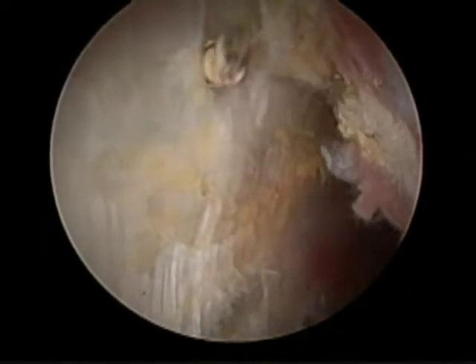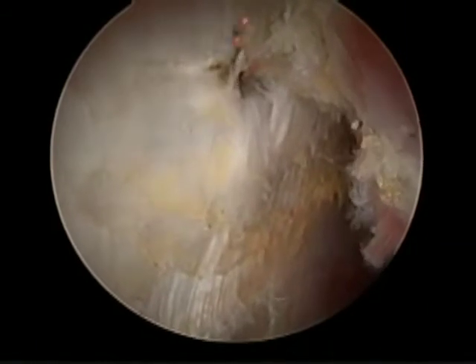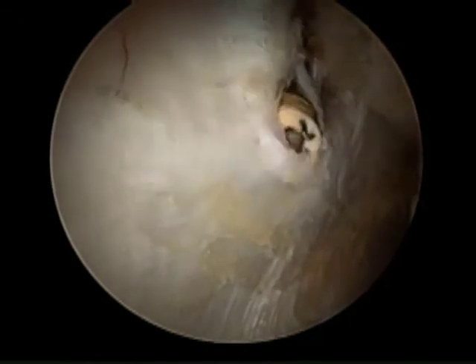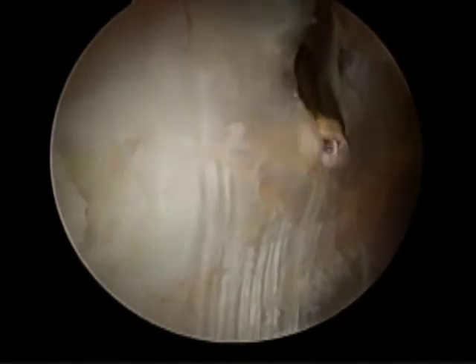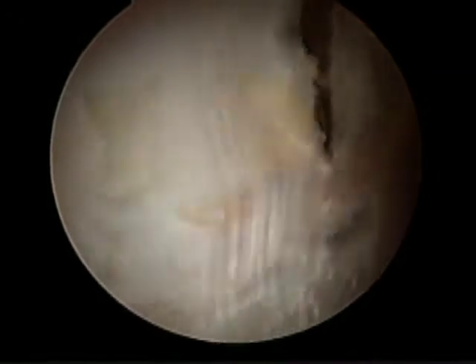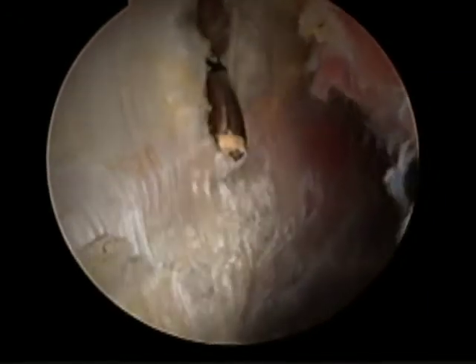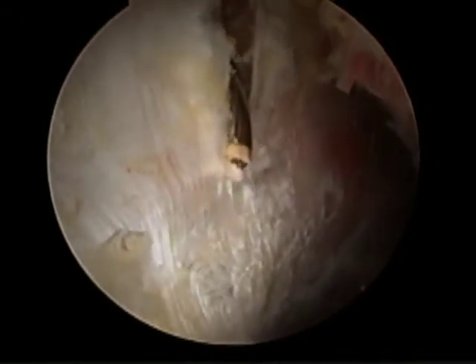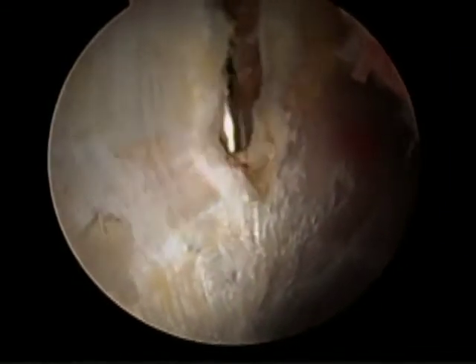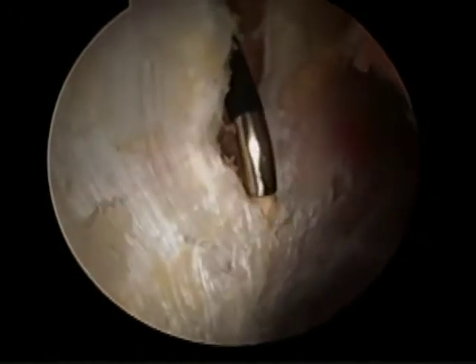The technique for release will involve a cruciform cut in the IT band. First, we'll perform a transverse incision in the IT band, and this releases the longitudinal fibers. Part of the tightness of the IT band stems from these longitudinal fibers, which run vertically along the leg.